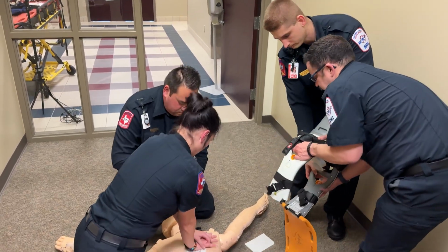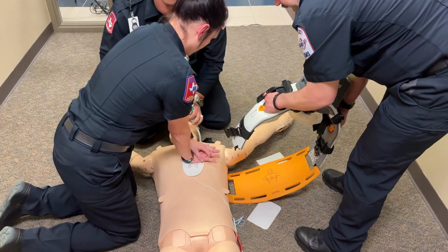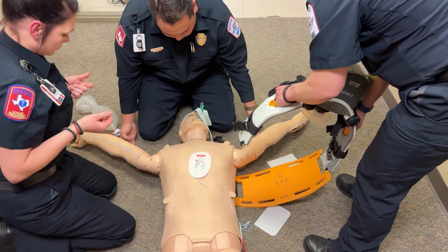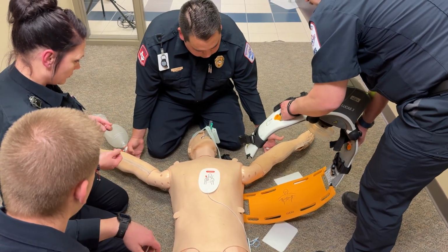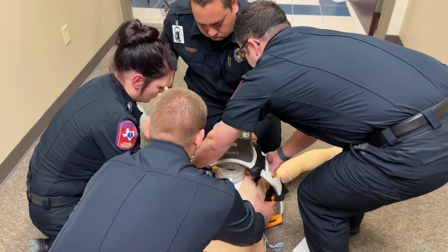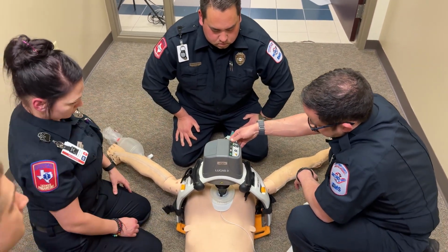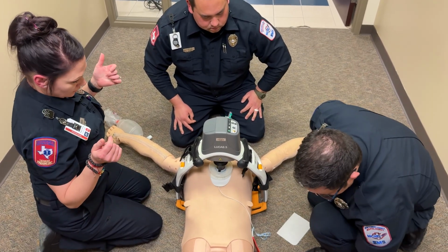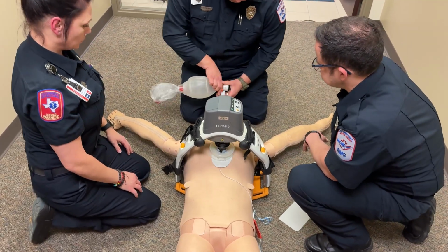But when we introduce a piece of equipment and we're combining that piece of equipment with an AED giving us directions, we have to be clean, calculated, and precise with good planning and good communication, closed loop, to get the pads on, to get the iGel in, to get compression started, and nothing can compromise our compressions. We have to have the minimal amount of pause possible because we know without a shadow of a doubt, that's how we get neuro-intact survival from cardiac arrest with good pit crew CPR.